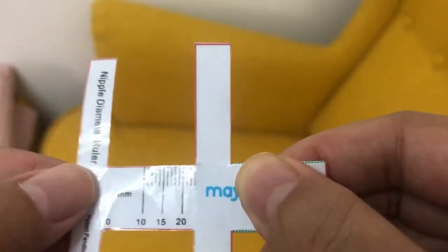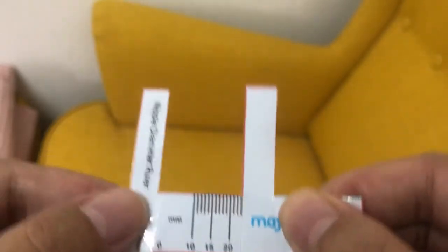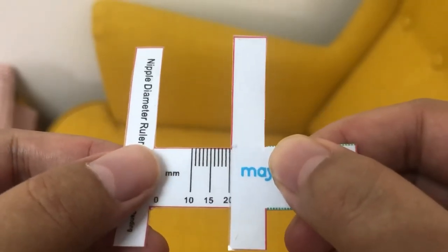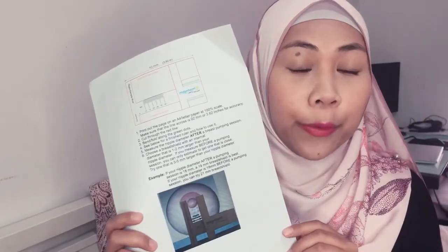If you are measuring before a pumping session, then you will have to add 3 to 5mm. The best time to actually measure is after a pumping session. Question of the day: what other methods do you guys use to know which is the correct flange size or breast shield size for you? Please share in the comments down below for everyone to benefit. Now that I've shown you how to use the nipple ruler, I'm going to show you how you can get this at home.